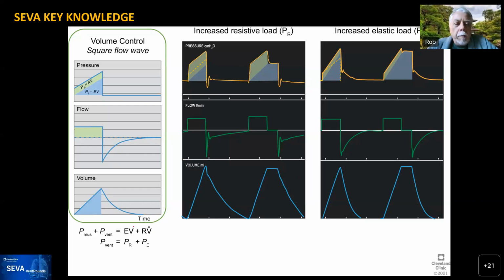That's wonderful. Thank you for highlighting that, Rob. And so here's the time constant, and I think that any person that manages a ventilator needs to be knowledgeable of the time constant. And Rob, would you want to talk to us about what the time constant is, please?